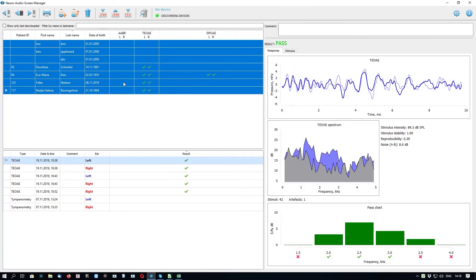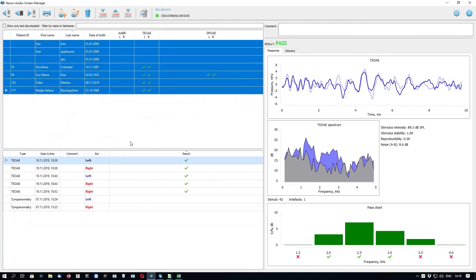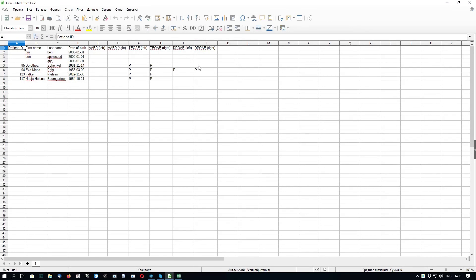There is also a feature to export statistical information to the open CSV format, allowing you to import this file into Microsoft Excel or another spreadsheet program like LibreOffice. Select the patients — for example, select all — then click Export to CSV, name the file, and save. The file will be exported to CSV format, which can be opened in any spreadsheet program. You can then perform additional statistical analysis, such as statistics based on hearing screening pass and refer results for each test.